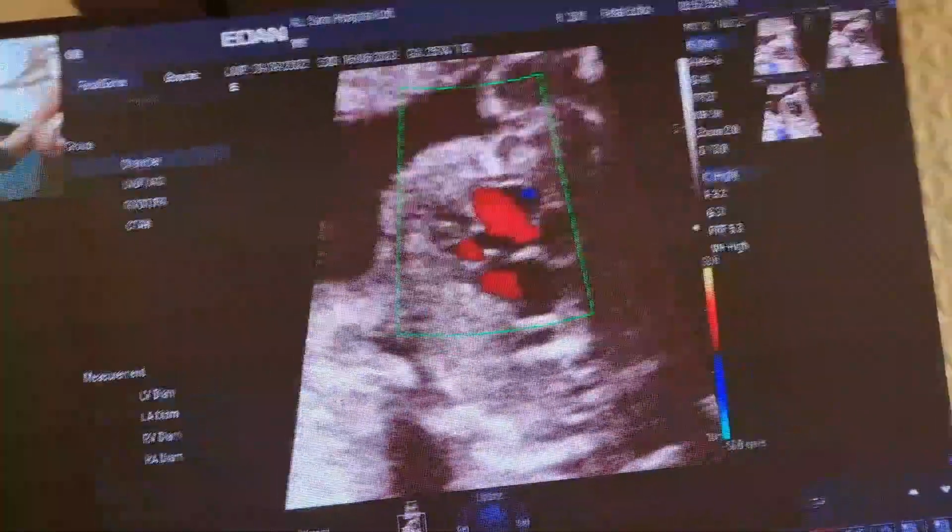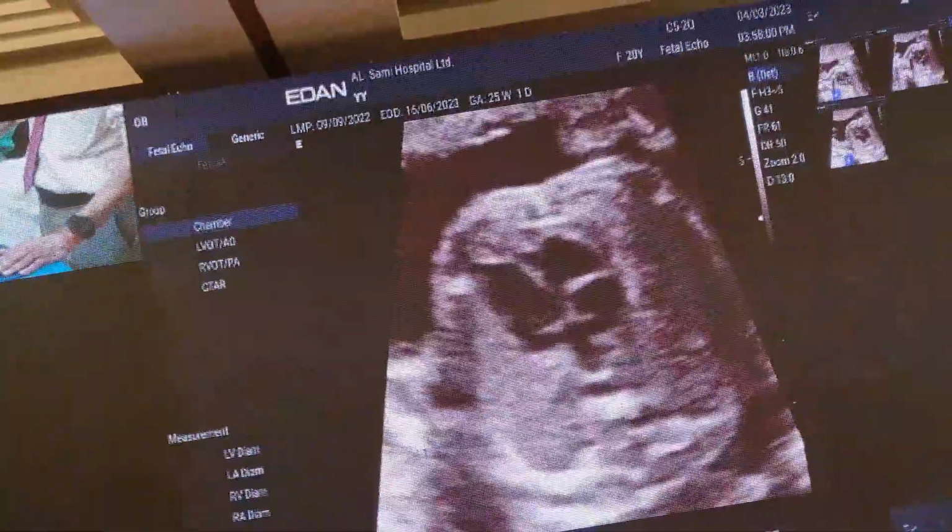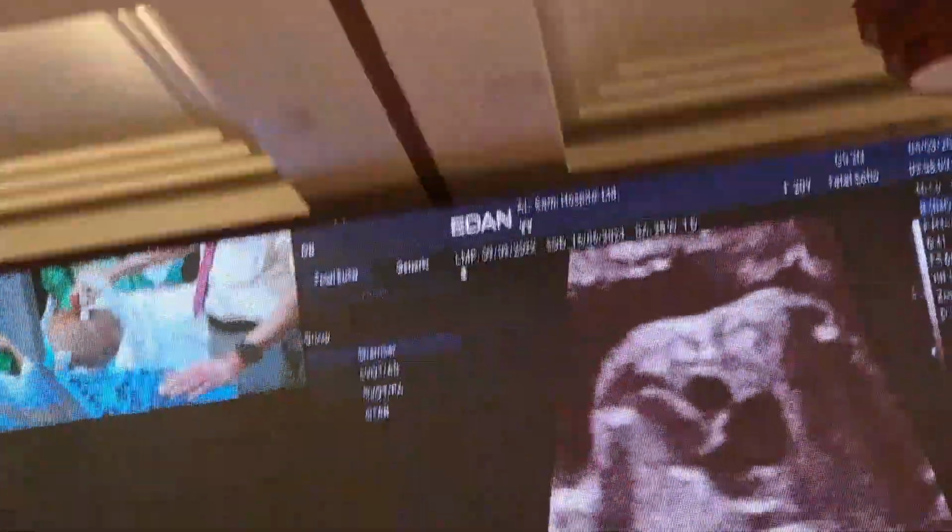Yeah, a little less because I'm in the flap of the foramen ovale. But as Joyti said, we have two things. The coronary sinus should not be mistaken for flow across the flap of the foramen ovale. Both the atria are of equal size, which is what we expect. We are seeing a septum primum. So this is what we need to appreciate. That's the septum primum.